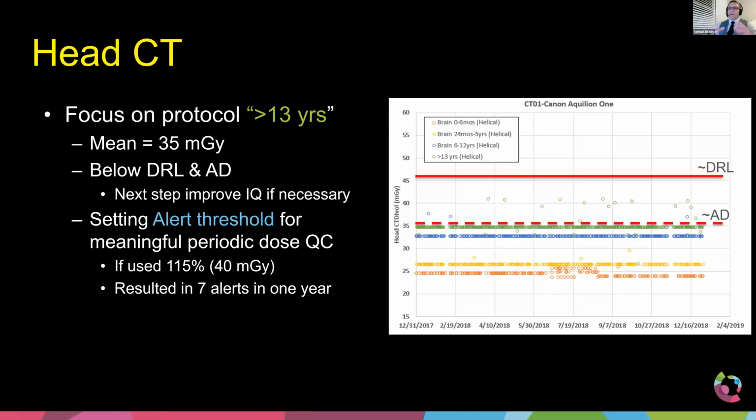So what I'm trying to say is, when something happens out of the ordinary, at least at our hospital, and I don't know how you do it in Thailand, the radiologist has to sign off on it. If the radiologist says, "Yes, do it again," then we already know that. And what'll happen, at least in our hospital, is the technologist will say, "Hey, this happened," and that's when people like me go, "Okay, I'll go look at it." Then that study will be sent to Radiometrics, and Radiometrics will have that really upper level alert that'll go, "Hey, this is 300% higher than it should be," and I would get that email. But I'll be honest, by the time I got that email, I've actually already been called, and I already know what's going on. So the answer is yes, you could do it.